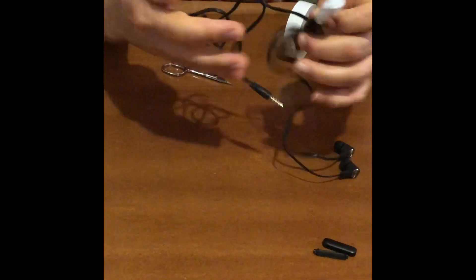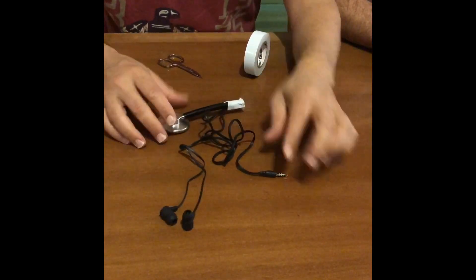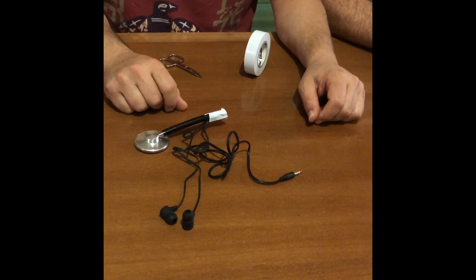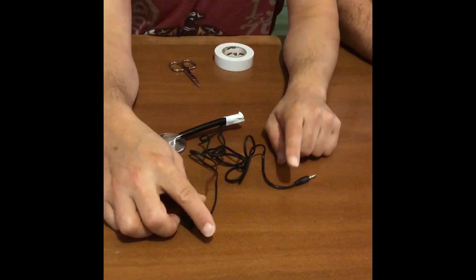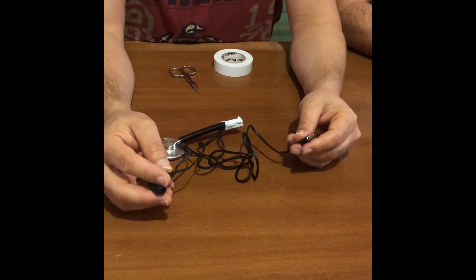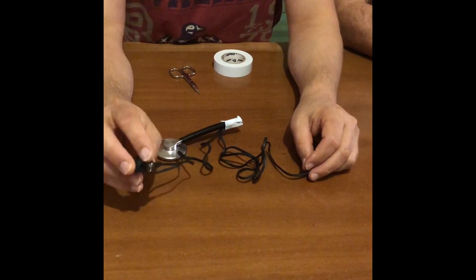All the components of the remote stethoscope are basically what you see in this image here. Make sure that the headset you take for this purpose will have a microphone and not only speakers.